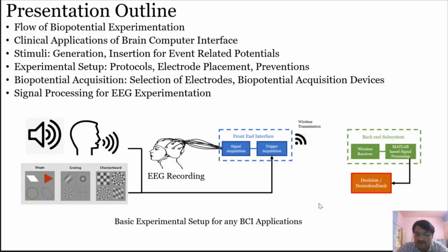So it will have an instrumentation amplifier, your filters, both kinds, band pass and band reject, a broadband amplifier, and finally a multi-channel ADC in order to convert the obtained analog value into digitalized form. Once you convert it into digitalized form, you have many wireless transmission protocols.